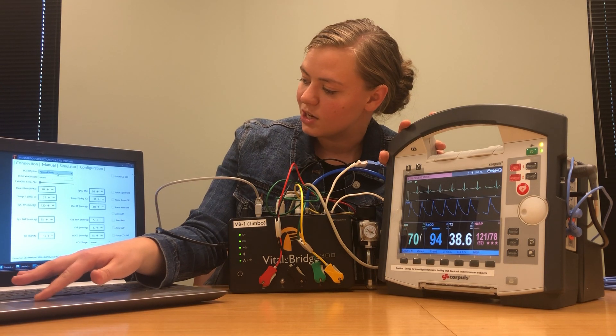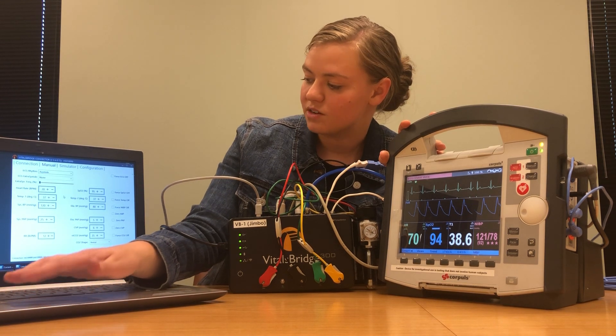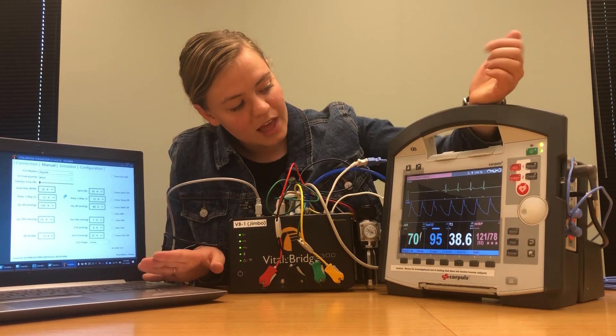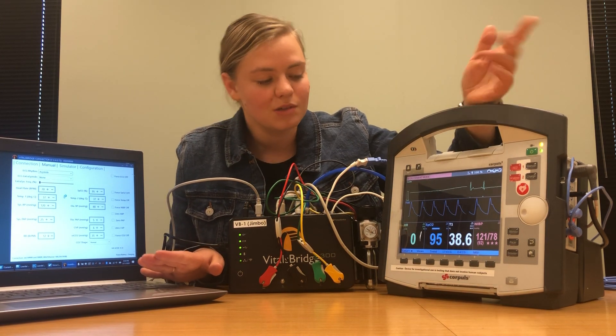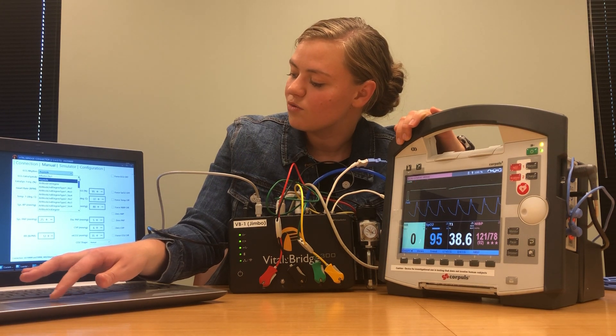If you want to verify everything is going through, hop onto your patient monitor and your VitalsBridge and pick a different waveform. I picked Asystole and we'll see it goes flat line, which is exactly what it's supposed to do. Then we can go back to our normal ECG waveform.